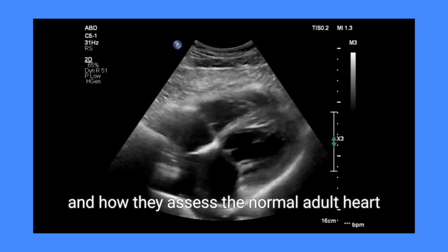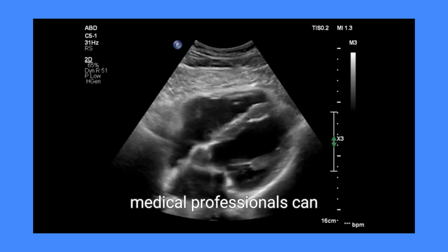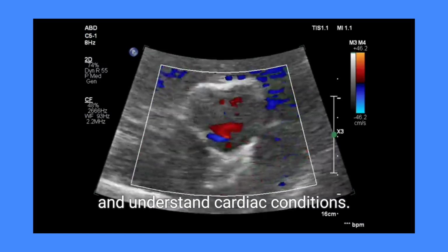So there you have it, an overview of subcostal echocardiographic views and how they assess the normal adult heart and aortic valve. With this knowledge, medical professionals can confidently utilize this technique to diagnose and understand cardiac conditions.